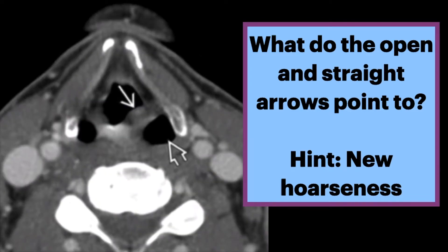At a slightly higher level in the same patient, we see asymmetric enlargement of the left piriform sinus, indicated by the open arrow. There is also medial positioning of a thickened left aryepiglottic fold, indicated by the straight arrow.